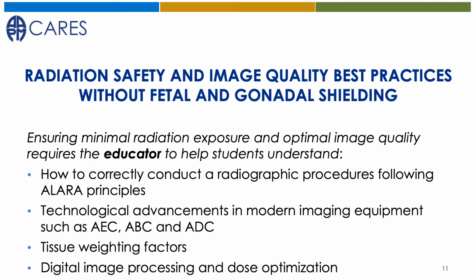As educators, it is paramount that we ensure graduates are competent to correctly operate imaging equipment following ALARA principles discussed earlier, including proper positioning, collimation, optimized exposure, and digital processing.